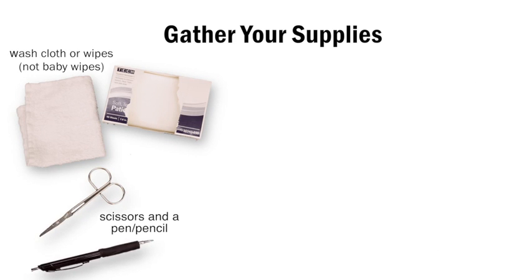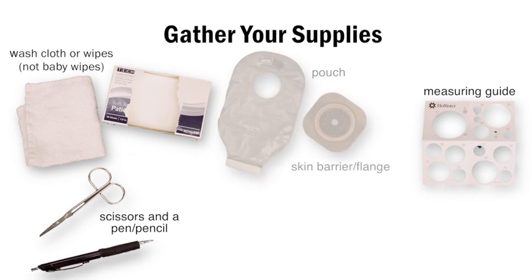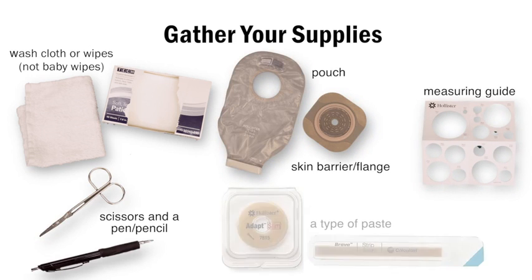You need a pair of scissors, a pen or pencil, measuring guide, a new ostomy appliance, and a type of paste, such as a barrier ring or strip paste.